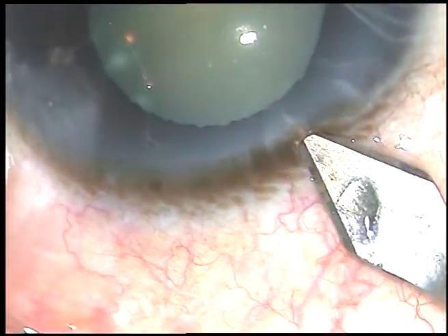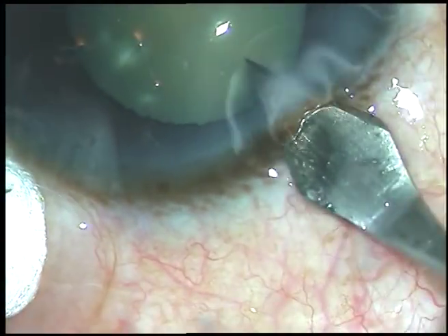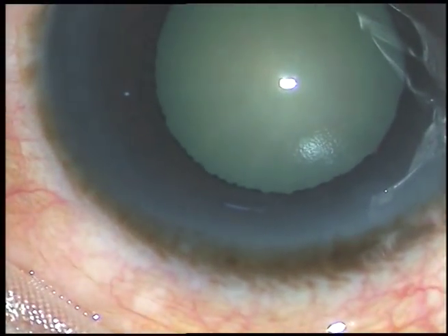Friends, this is a cataract with a poorly dilated pupil. I have taken up this case for surgery. Let us watch the surgical steps.